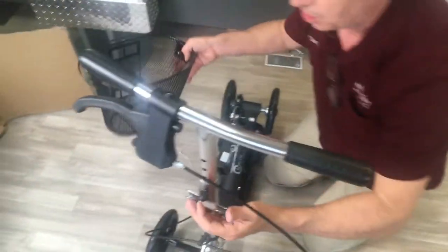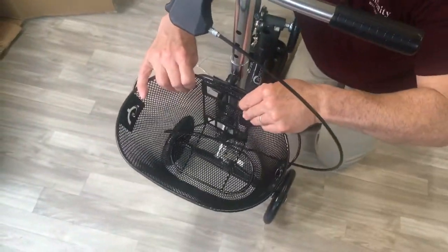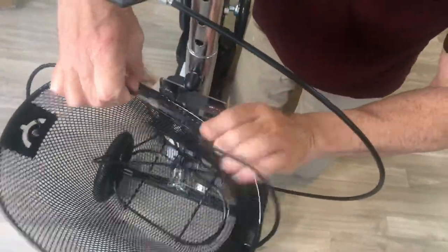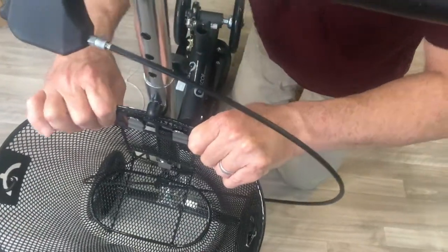While we're here, let's go ahead and put the basket onto the front. You get a nice little basket — it is optional, but most people like it. It makes it a lot more fun to use; you don't have to carry anything around. It just clips right on there.